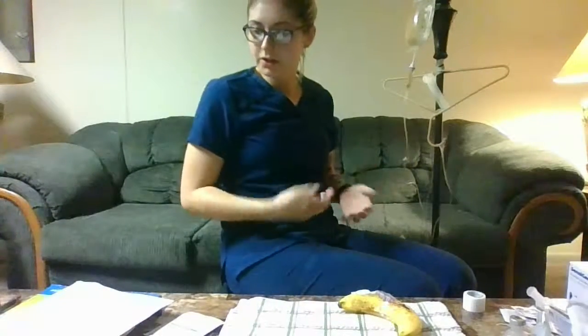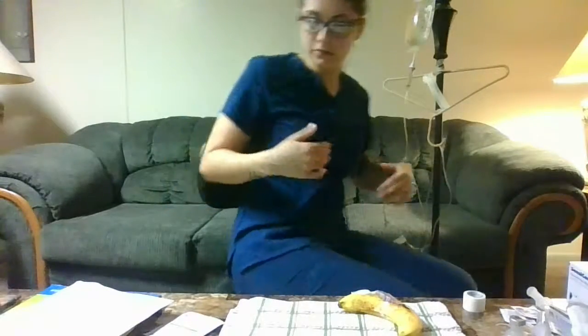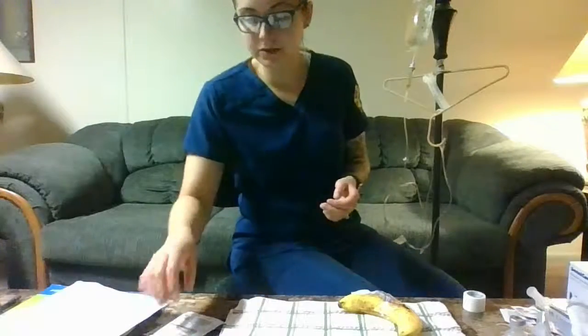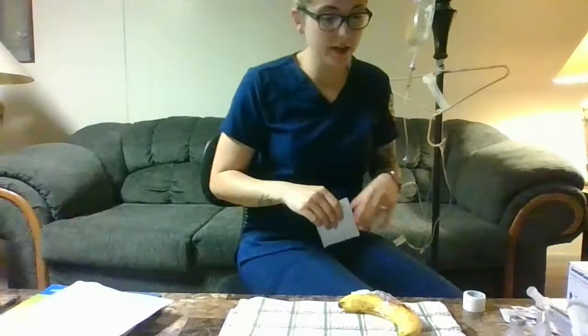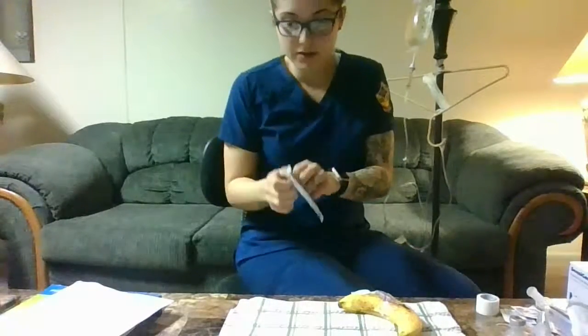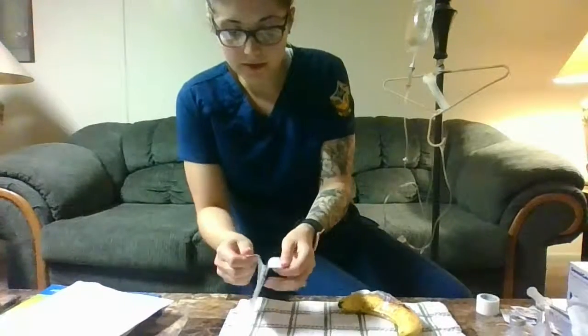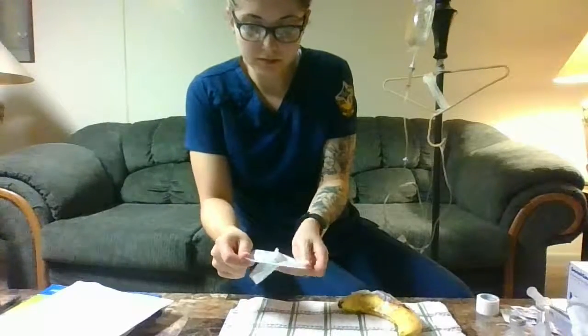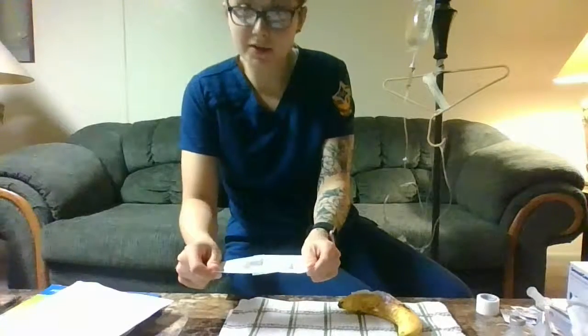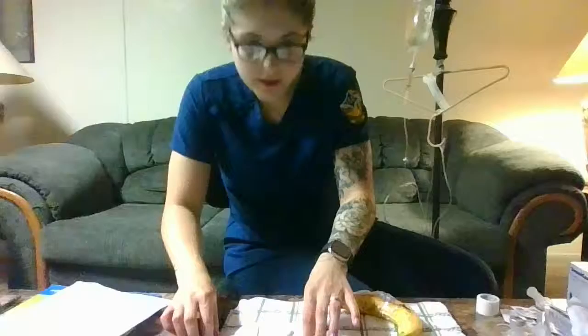So it looks like there's an order to discontinue the IV infusion after the last dose of chlorpromazine. So we're going to get our equipment ready. We're going to get some gauze pads, sterile dressings, some Coban. We're going to open this up so that's ready. Open the gauze up so it's ready. While we're doing that, we're going to explain to them that it's time to take out the IV. So we have that ready there.